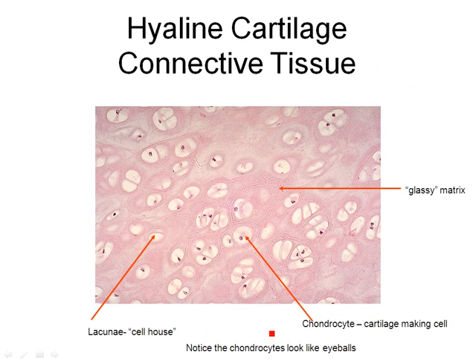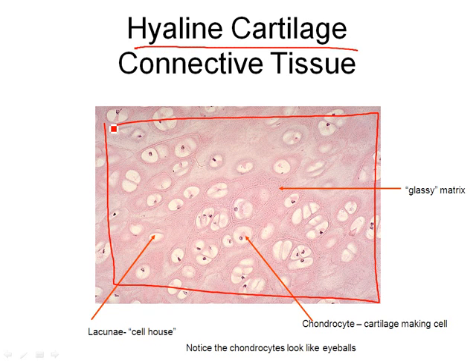Here's this hyaline cartilage. Remember, we have different types of cartilage. We have elastic cartilage, fibrocartilage, and hyaline cartilage. The one we're going to have you know for the lab part of the exam is hyaline cartilage, which you associate with bones, and it's found in your nose and connects your ribs to your sternum. It has this glassy kind of pink color, and it's got what looks like little bubbles inside of it.